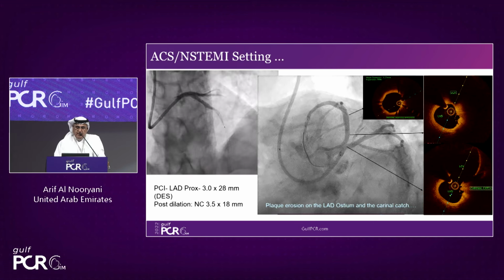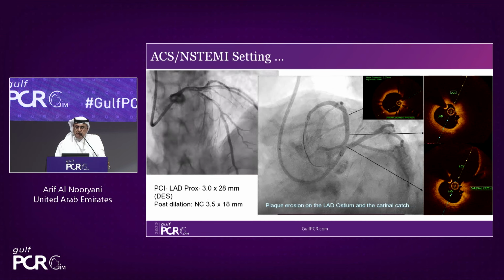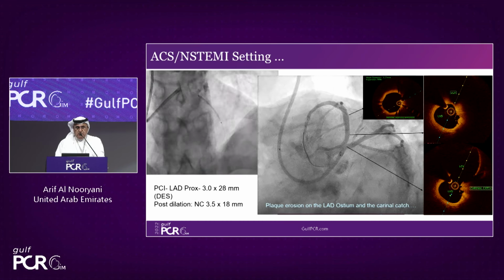But look, by coming back now, everyone would have stopped here, and we thought we would do a control OCT. And if you look back here at the bifurcation, the right lower image on the right side, there is at the ostial LAD some kind of erosion and protrusion, a little bit of material at the bifurcation. At 12 o'clock is the circumflex, and the down is the LAD. So we have discovered there is something there. So let's see what is to be done here.